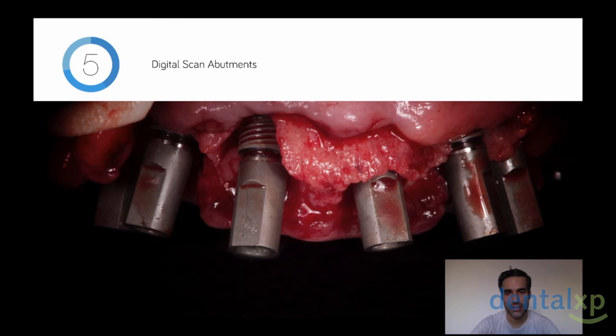As you can see, there is a flat zone in these scan bodies that is oriented toward buccal. Right now we change the protocol. We place this flat region toward palatal. Why? Because we saw that a great reference for the scan is the palatal wrinkles. So if you start scanning from the palatal, it's much easier.